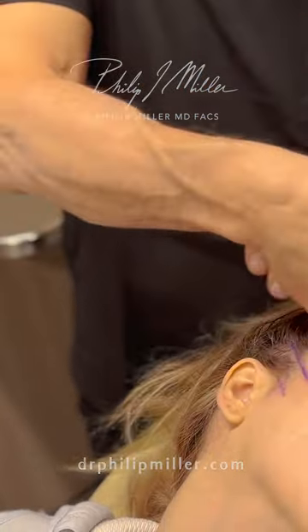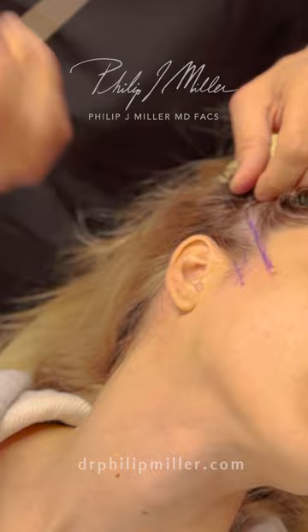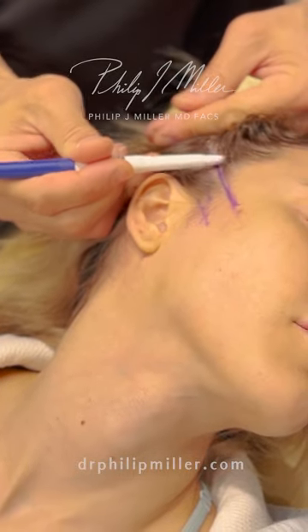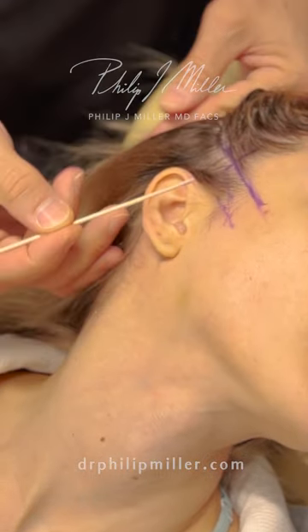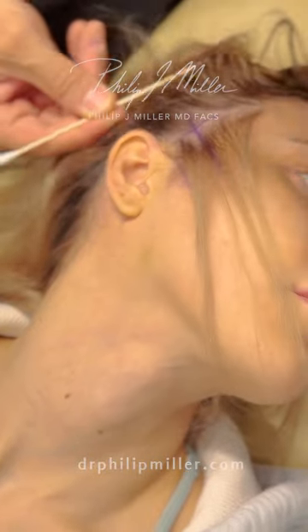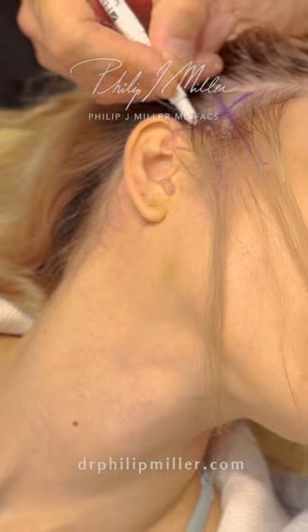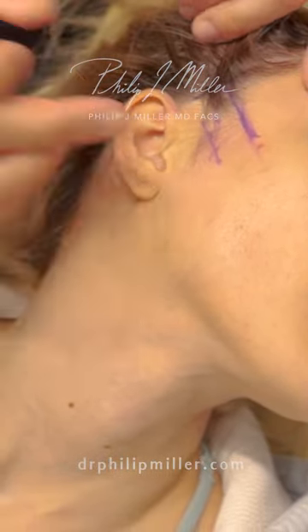Now I'm going to follow that line straight up into her temporal area like that. And then we're going to go perpendicular to that line to create the incision line. We want to keep it in the hair, and we're far enough away from the course of the frontal branch.